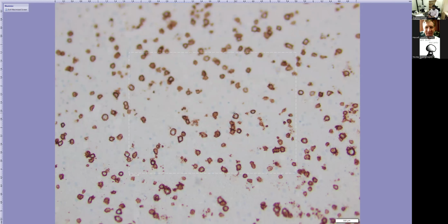Because if you remember, this patient has been getting treated for a demyelinating disease, so he got some immunosuppressive drugs as well. So an infectious etiology, which leads to this kind of large cells in the brain, can cause this picture and can also have what we call a pseudoclonality. So immunoglobulin gene rearrangement can support, but it is not going to help us make the final diagnosis.